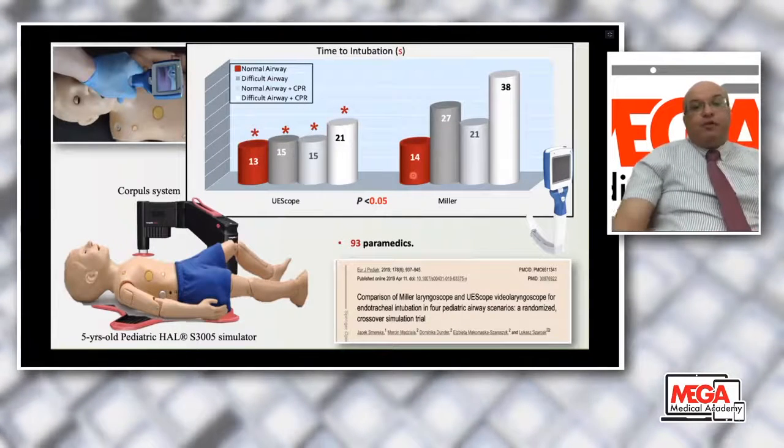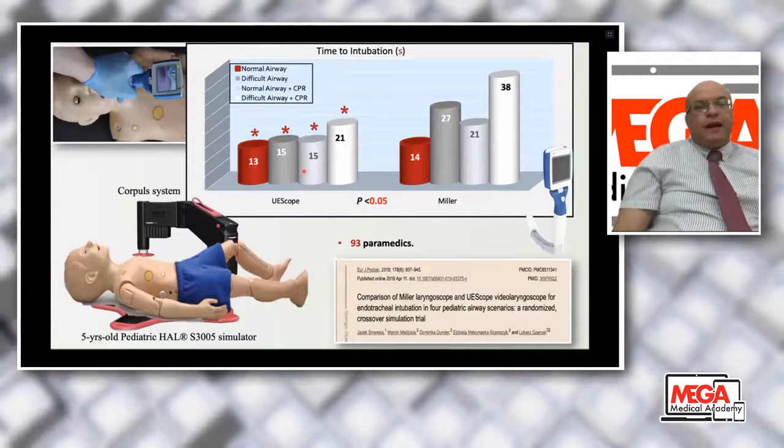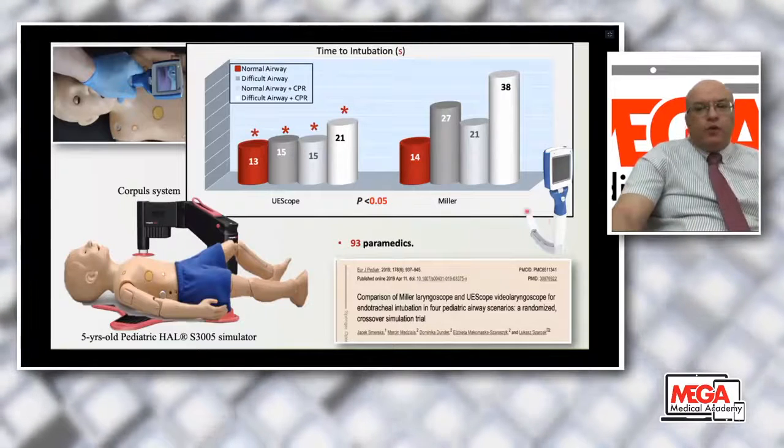Also, time to intubation was significantly less in all scenarios of normal and difficult airway, with and without CPR, using UE scope.